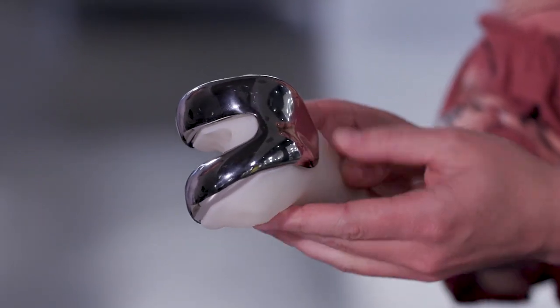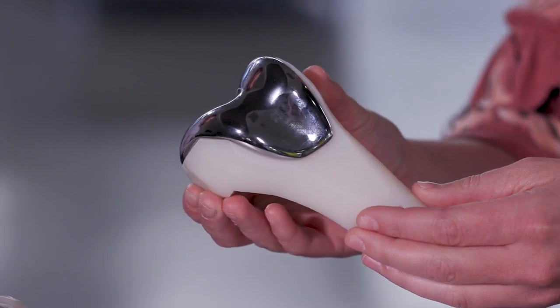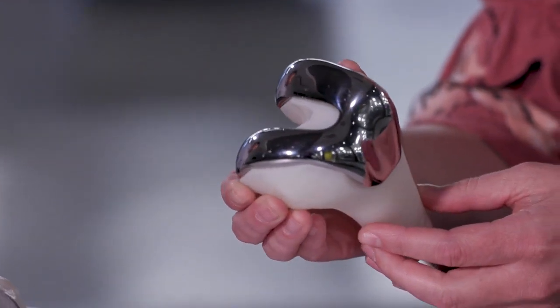This one over here is the femoral component of a total knee arthroplasty. Conventionally, these are made from a casting in Cobalt Chrome. With the introduction of the Flex 350 dual, as well as a validated Cobalt Chrome parameter set, we're able to print these at a cost-competitive margin to what a casting would be able to produce. You can also then have a porous-backed Cobalt Chrome to produce that osseointegration that we like out of a lattice structure.